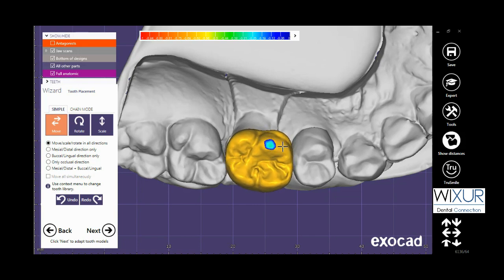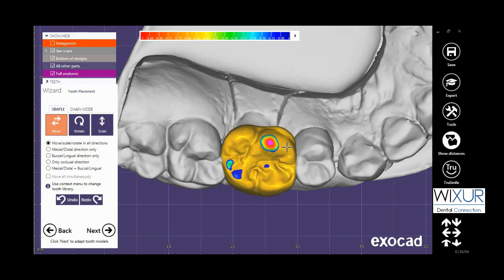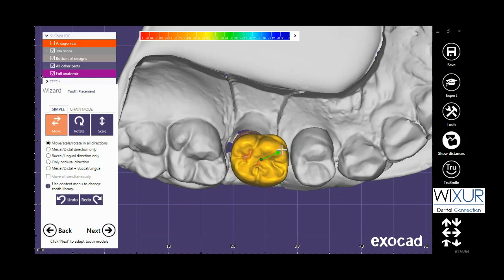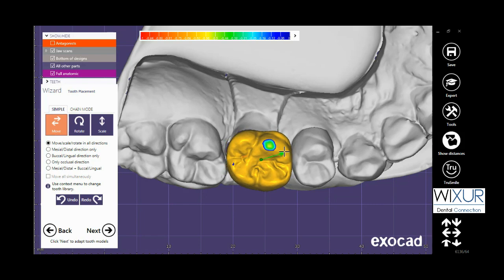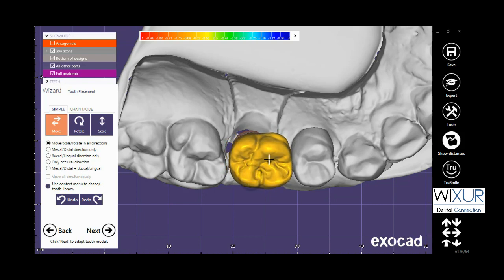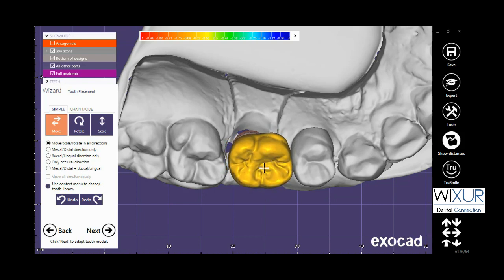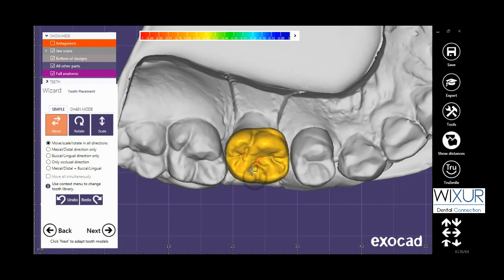By holding the Shift button on the keyboard and left mouse click, I can scale the crown. And by holding the Ctrl button and left mouse click, rotate is activated.